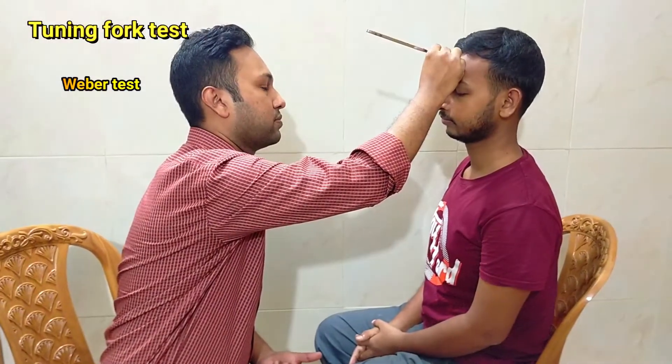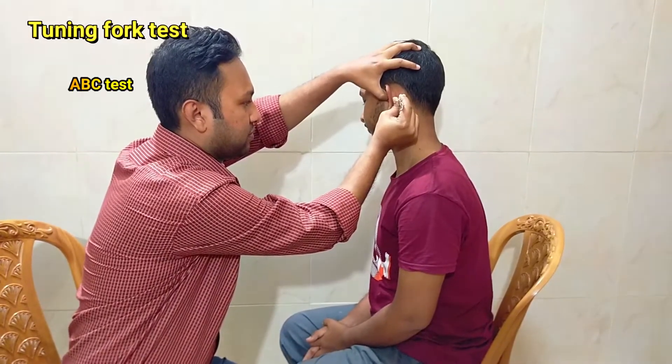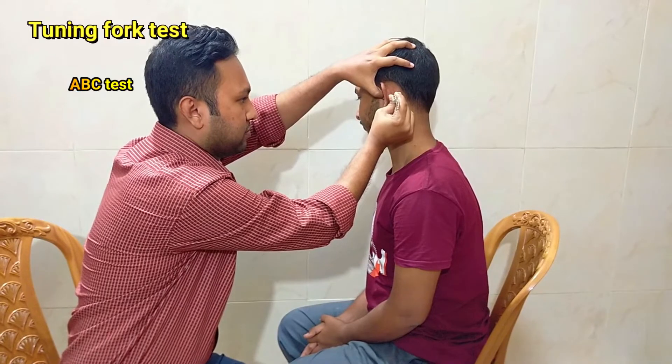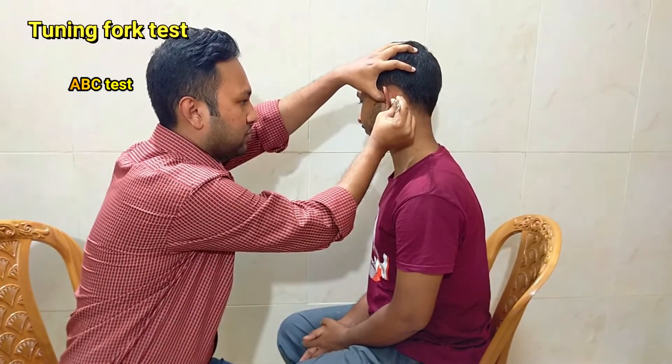For doing the Weber test, after striking the tuning fork, it is kept over the forehead and the patient is asked to compare the hearing of both ears. For doing the Absolute Bone Conduction test, the vibrating tuning fork is kept over the mastoid bone, occluding the external auditory canal. The patient is asked to signal when they do not hear the sound anymore; then it is quickly brought onto the mastoid of the examiner while occluding the external auditory canal, thus comparing bone conduction of the patient with that of the examiner.